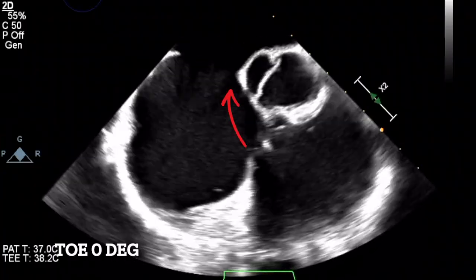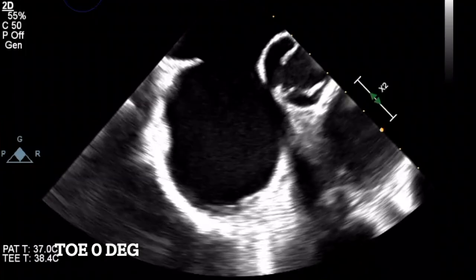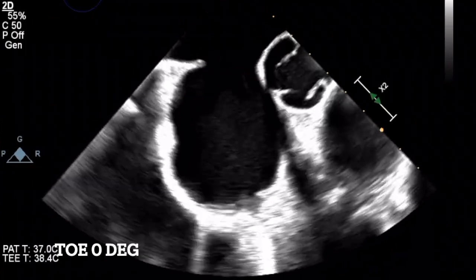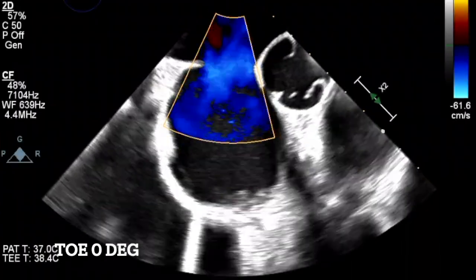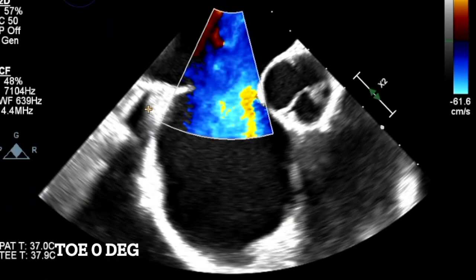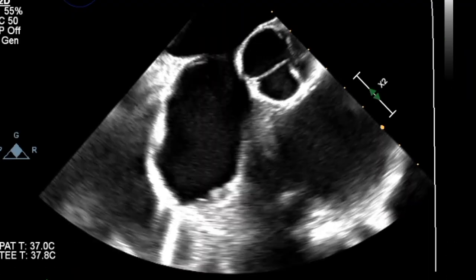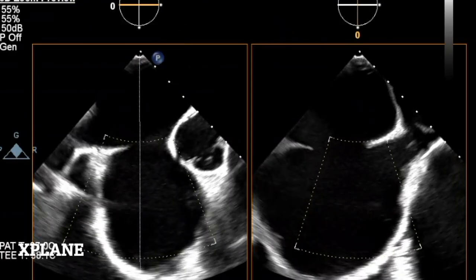And so we deal with the anterior border, which is the aorta, and we'll deal with the superior and posterior border, which is also in that picture. And then we go around and try and measure on colour. Colour flow gives you a more accurate dimension. As you can see on this measurement, it comes to about 24 millimeters, but this is a three-dimensional structure, and so we do need all the boundaries.